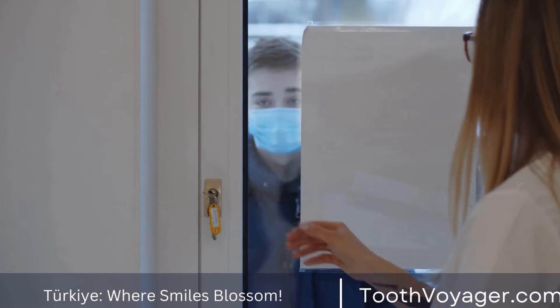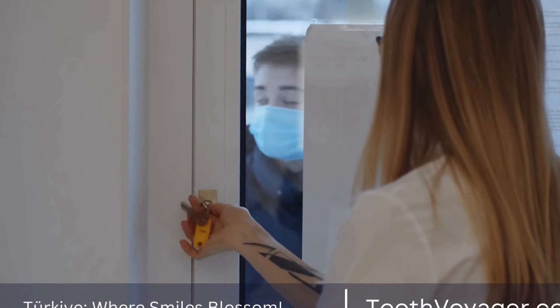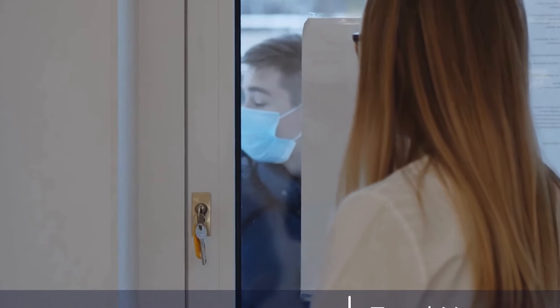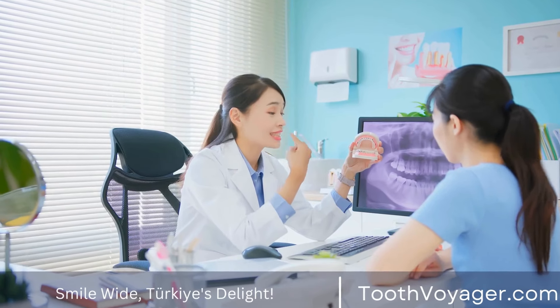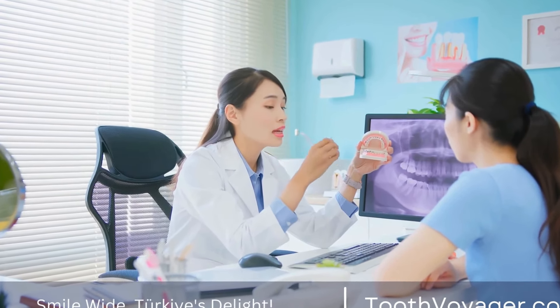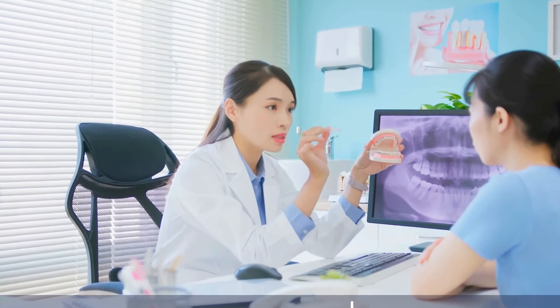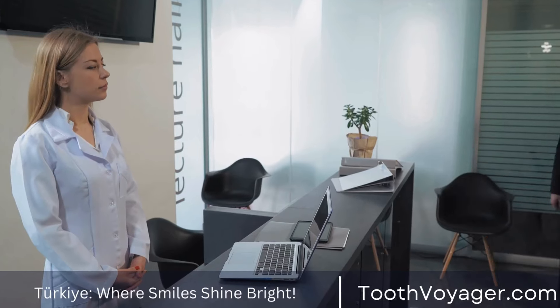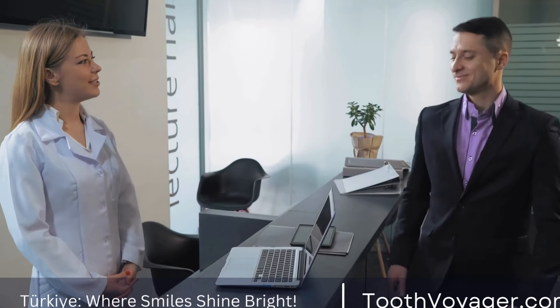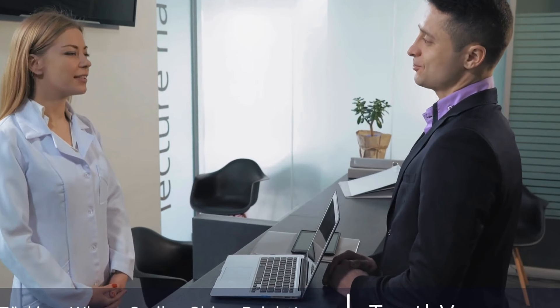The root canal procedure is a standard procedure used by dentists to preserve a tooth which has decayed or is infected. Although it might sound daunting, it is an extremely easy and efficient method to protect the tooth's natural structure and avoid the necessity of extraction. In this short video, we'll walk you through the steps of root canal therapy and show how it will aid in maintaining a well-maintained smile.